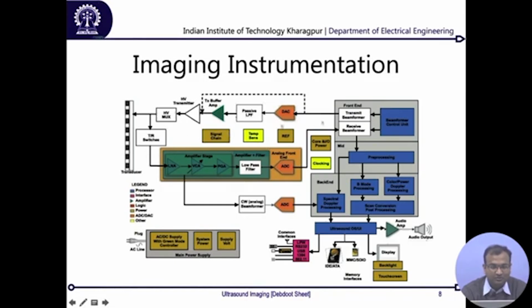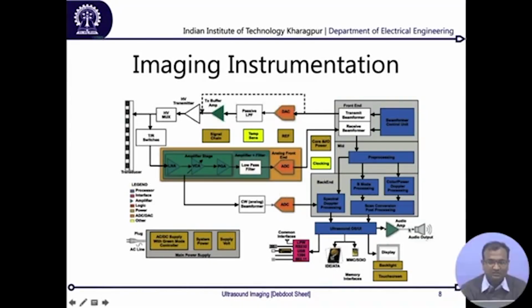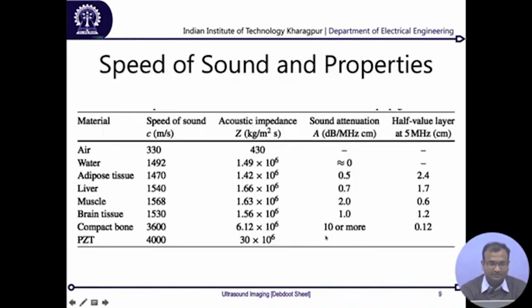This is just to stop that. Over here we have the back end, where the rest of the post processing goes on. So all transducer readings are captured and sent over here. In this part it tries to find the difference between the repetition sequences coming at multiple transducers, and from there interpolates where in space my actual abnormality, or the actual reflector of ultrasound, is located, which sums up the total principle of an ultrasound imaging system.